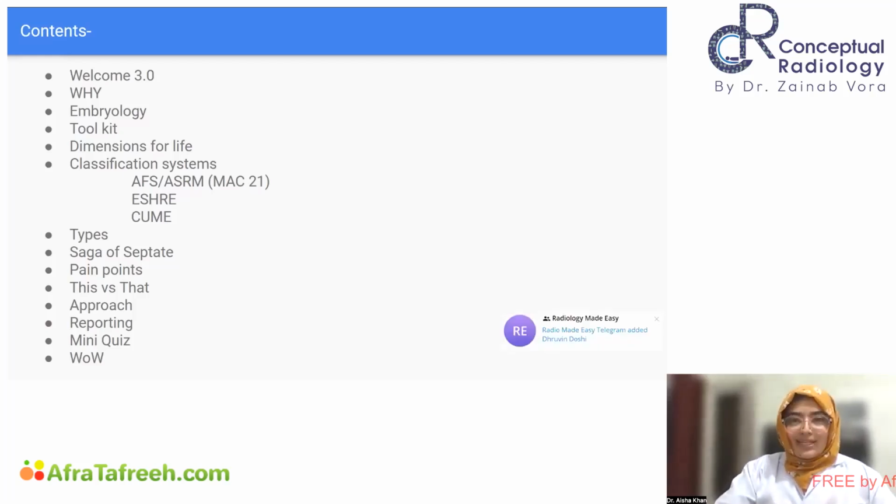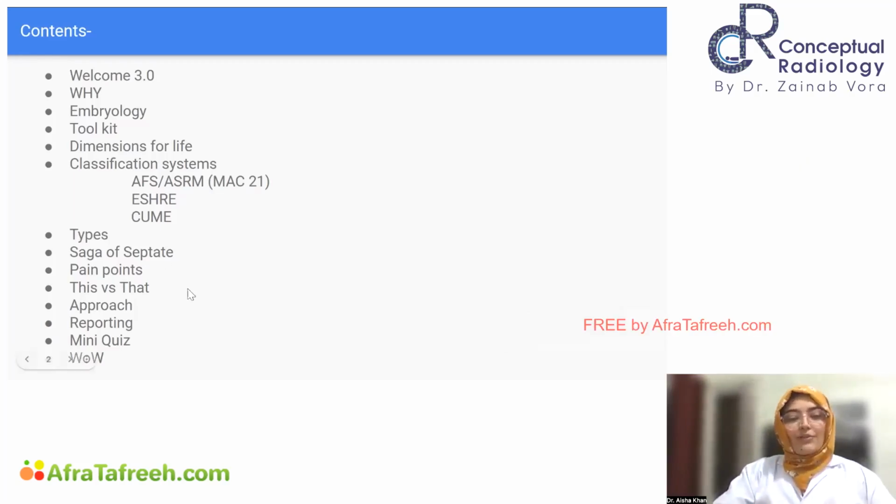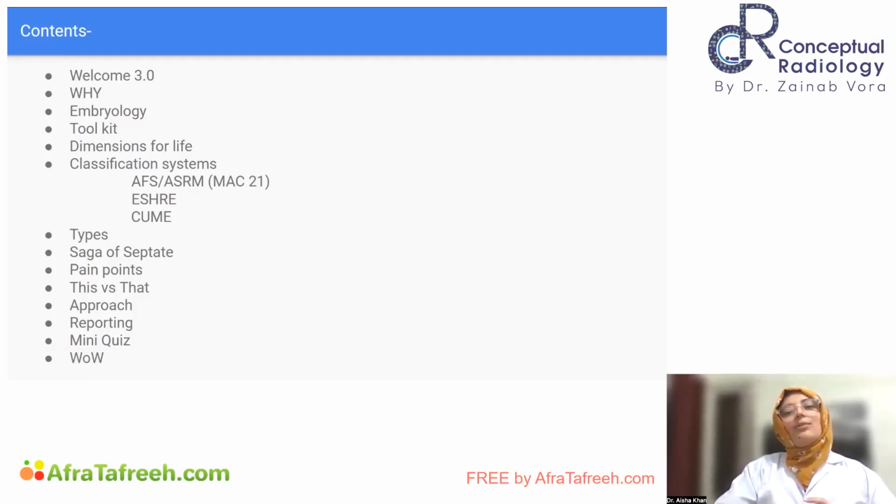The saga of septate will be a short story. Then some pain points in everyday reporting, this versus that. A lot of confusion is there about whether to diagnose a bicornuate or septate uterus, so that will be addressed further. Then finally, I will tell you an algorithmic approach, so that next time when you are in your OPD and a case of Mullerian anomaly comes, you will know how to approach that case. Then we will talk about reporting. If time permits, I have a mini quiz for you guys to test our knowledge at the end of the session, and we will be ending with some words of wisdom.